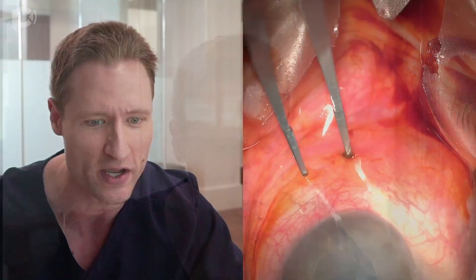The graft is just smeared in between the back of the cornea and the front of the iris. These are actually the most challenging eyes to deal with, and I want to show you a case we dealt with in one of our patients in our office-based surgery center just last week.